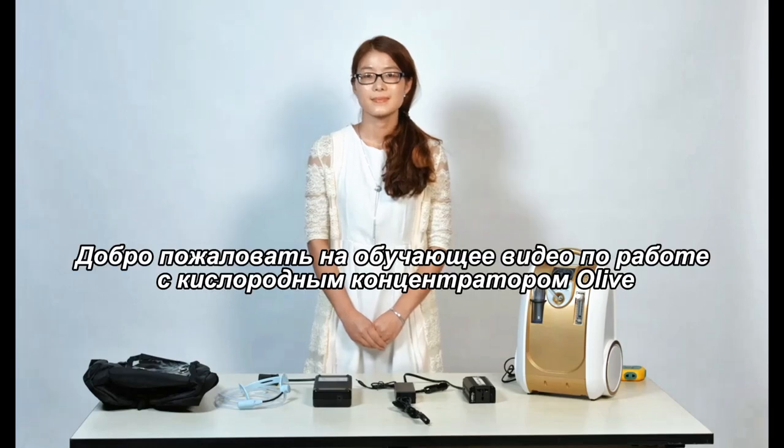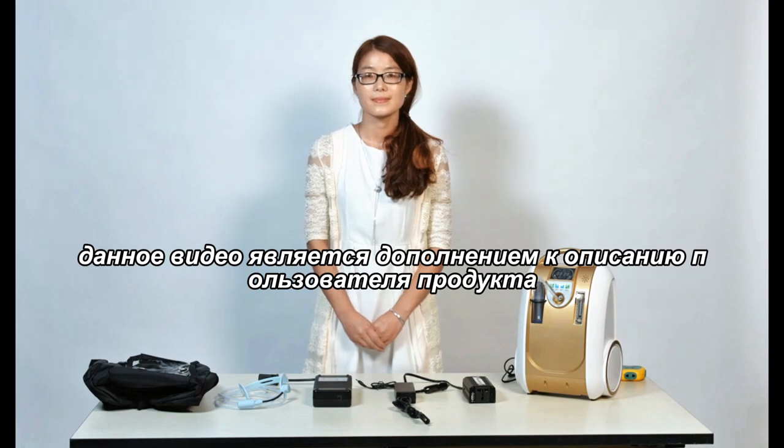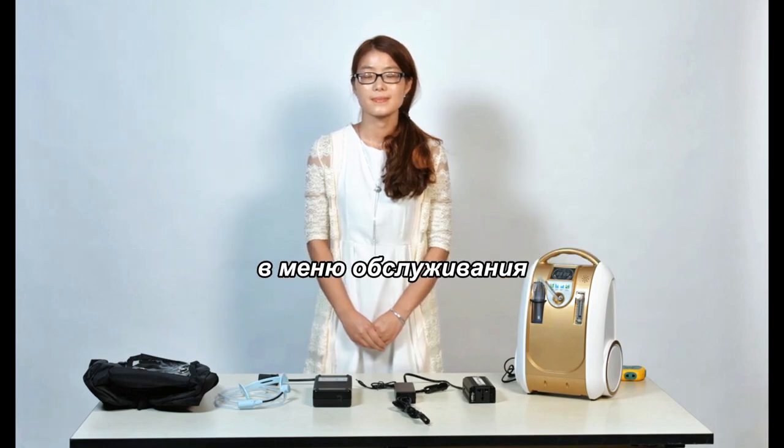Welcome to the Olive Oxygen Concentrator training video. This video is intended to supplement the product user and service menus.